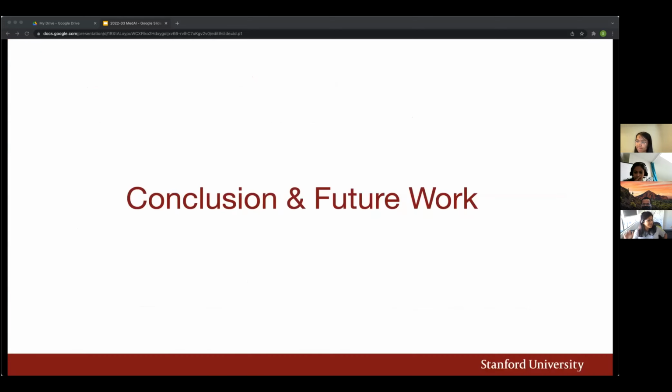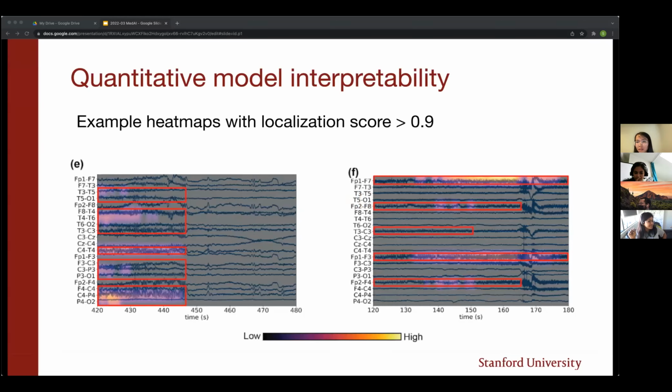The only thing that is kind of strange to me is, when you show the heat maps, if you analyze the discrete values in those signals, it seems that they are analyzing it in a continuous manner, right? The emphasis was given on the full signal data, not on some portion of the signal data. I don't know what the reason for that is. Sorry, you mean this figure in particular? Yeah, the heat map. So we actually didn't show the heat map for values below 0.5. Ah, okay.